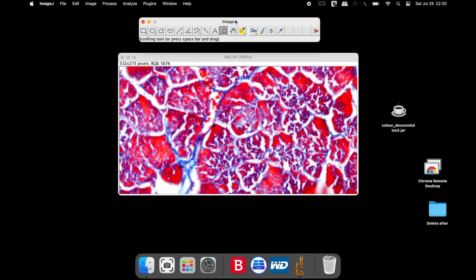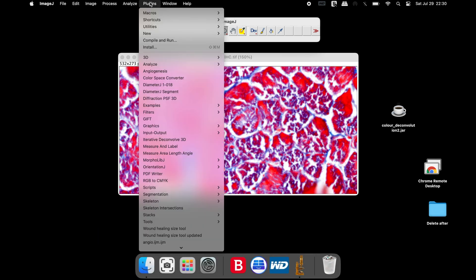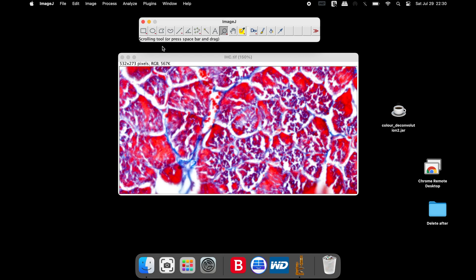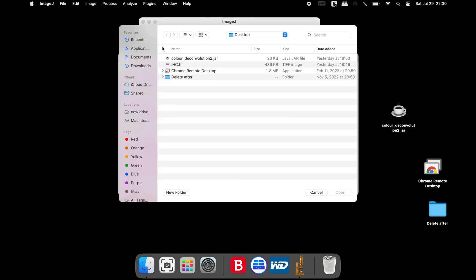To install the plugin, click on Plugins, Install, select the Color Deconvolution 2 plugin and save it.